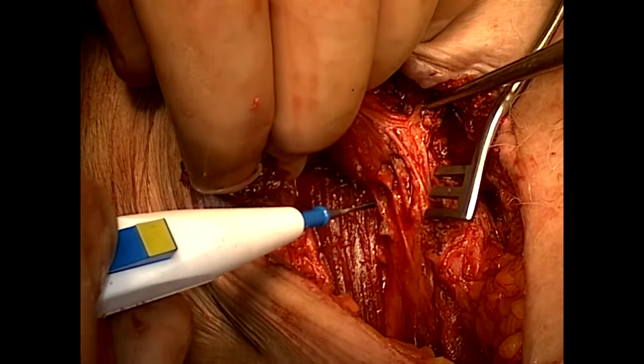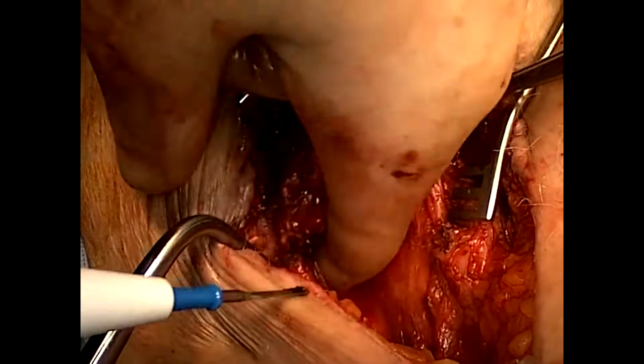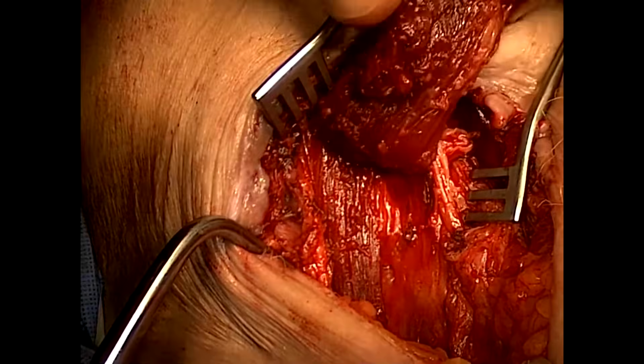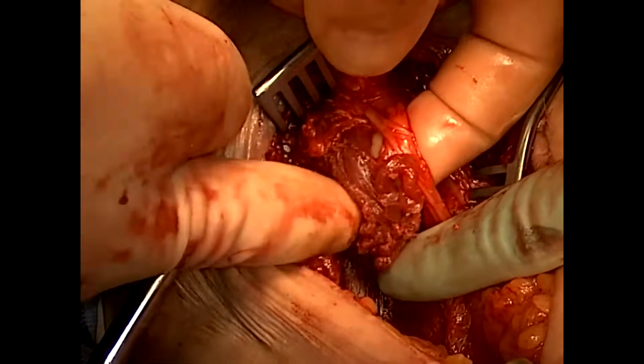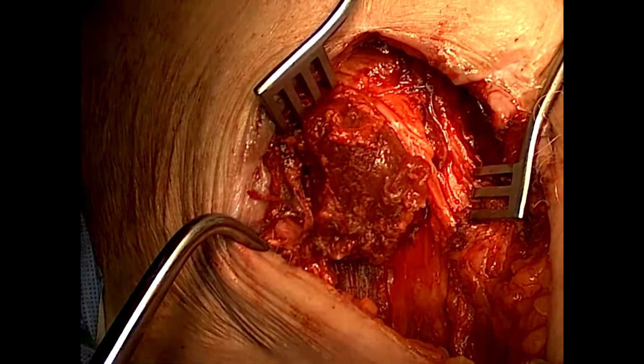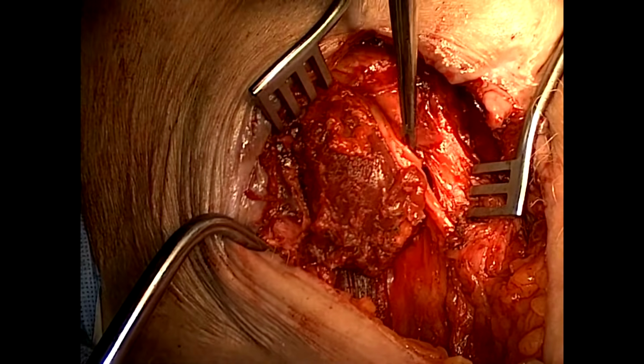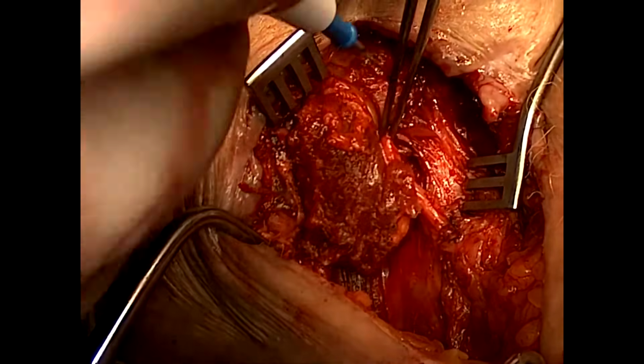So this is called distraction. We're actually putting the clips on the perforators because we rotate the thing completely over. I've never seen a dead sartorius muscle. Every single one of these I've ever re-operated on that's fully circumferentially mobilized is dead. Yeah, no, never happens. Three kinds of lies in medicine: lies, big damn lies, clinical impressions. Statistical lies, yeah. All right.